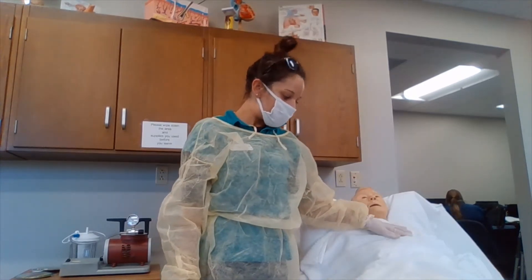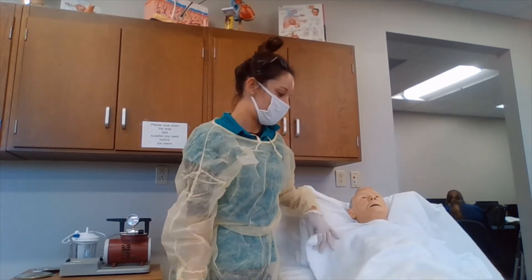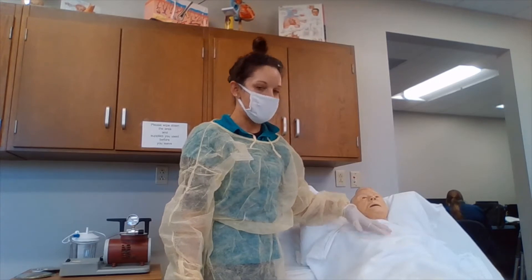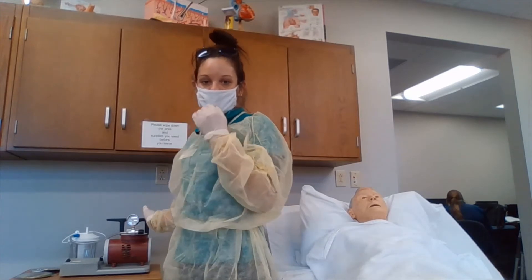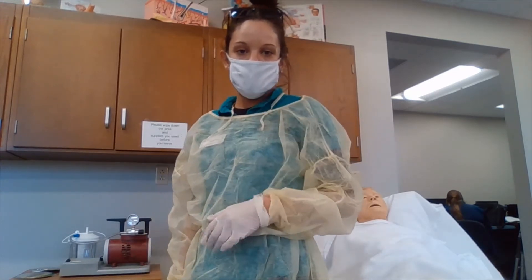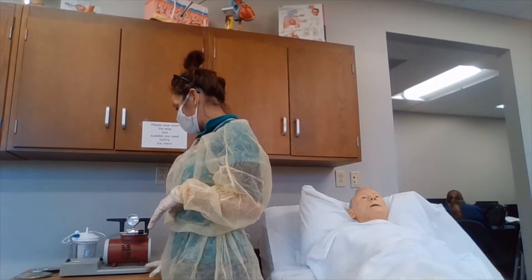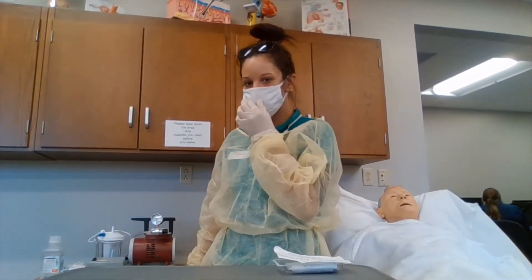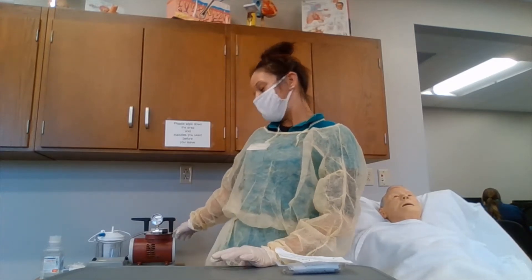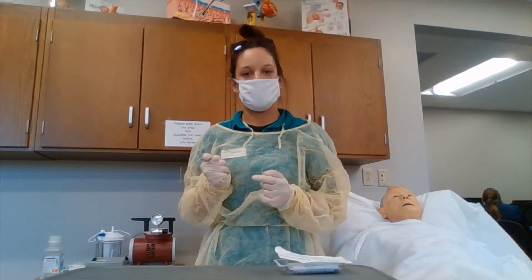We're going to be placing either a pad or a linen saver on top of the patient's chest. We are also going to be turning on our suctioning machine and adjusting it. The usual adjustment for adults is 100 to 150 mmHg, for children 100 to 120, and for infants 50 to 95. We are also going to test the suction by occluding the tube that connects to it.